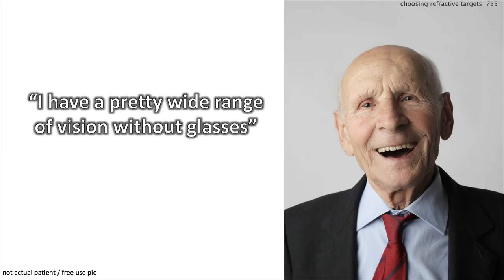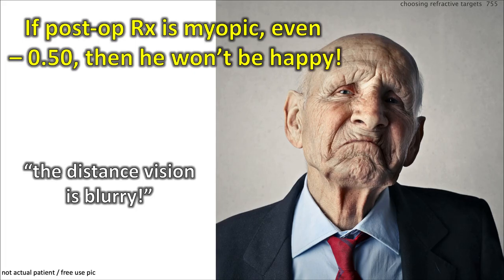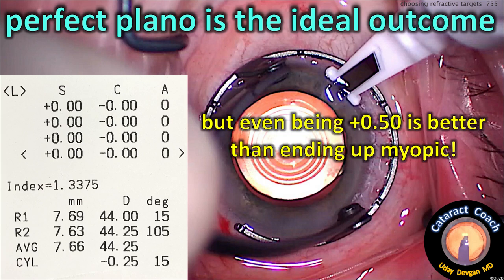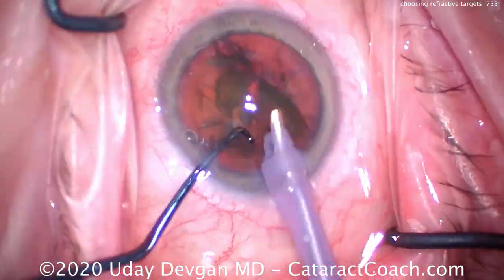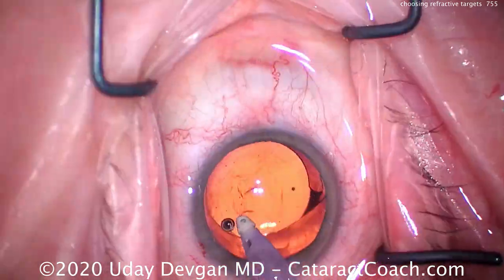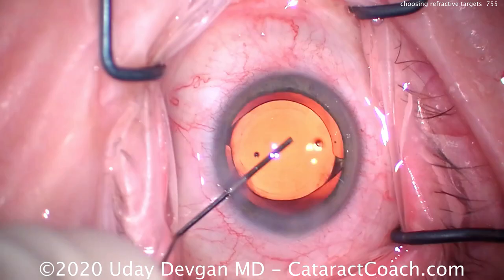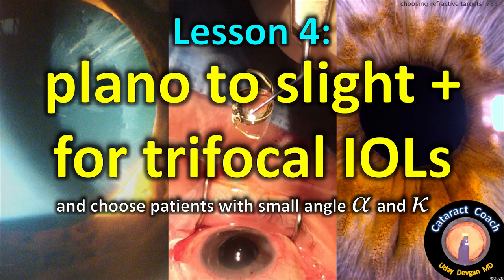So now he's happy — a pretty wide range of vision without glasses, and the night vision, glare, and halos aren't too bad. Trifocal lens targeting: the ideal goal is plano. If you end up myopic, even just a little bit, the patient probably won't be happy — they'll say distance vision is blurry. Even if they end up slightly hyperopic, that's better than ending up myopic. During surgery, phaco-chop in the capsular bag to implant the trifocal lens. The key is to line it up and center with respect to the Purkinje images — the first Purkinje image is the reflection off the anterior corneal surface, and the fourth is the flipped reflection off the posterior aspect of the IOL. Line both up with the visual axis. Lesson four: target plano to slight hyperopia for trifocal IOLs, and choose patients with small angle alpha and angle kappa.